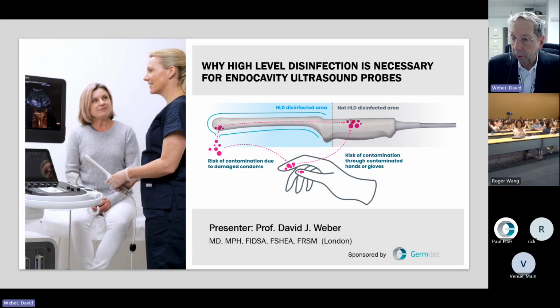Thank you very much for asking me to provide this presentation. It's a great honor. Over the next half hour, I'm going to talk to you about why high-level disinfection is necessary for endocavity ultrasound probes, and then we'll have time for questions and answers.